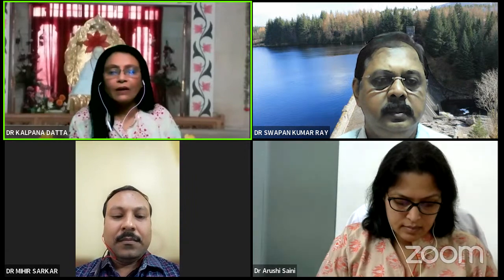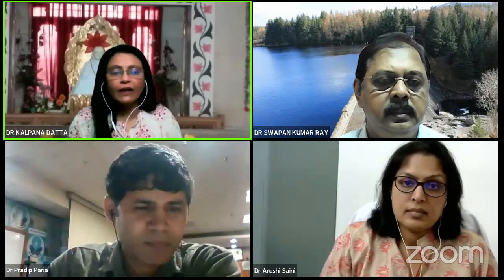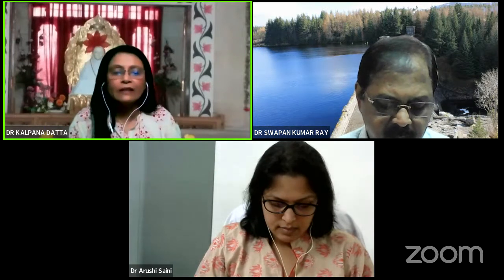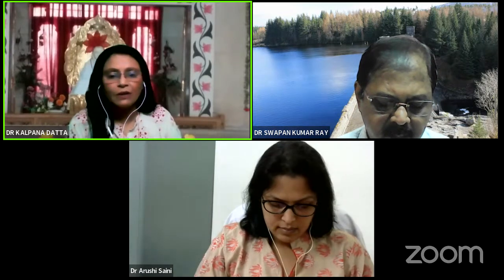I'm really happy to see this is the third webinar in the consequence of the month, and the last two were a great success. Keeping in mind the theory exams for the postgraduates, especially in West Bengal in the MD exam, and there is going to be a practical exam, they don't take separate CT scan radiology classes during their tenures. Hardly we take 1 or 2 classes. So I think we have arranged for that, and it will be very helpful for them to know the basics of neuroradiology and radiology of the pulmonary system, X-ray chest and all.